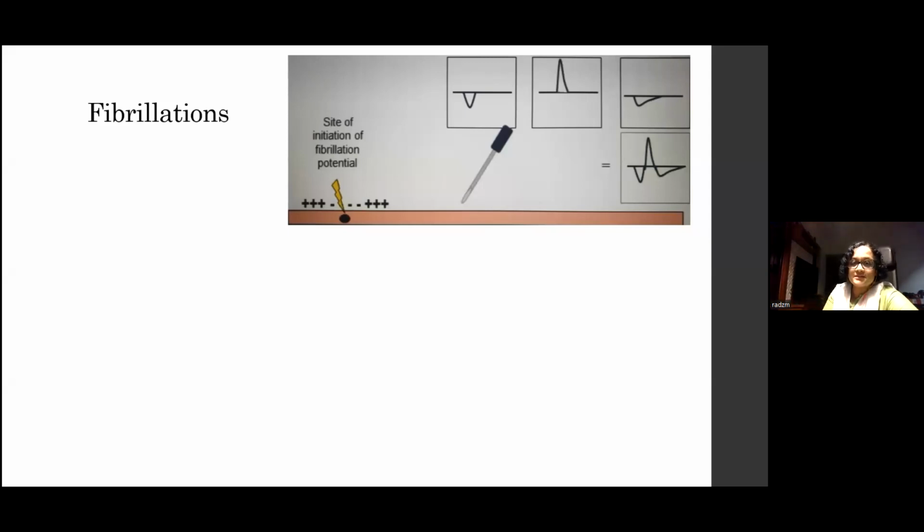So coming to fibrillations. Now, fibrillation is abnormal. It comes because there is damage either to the muscle fiber itself, as part of a myopathic process, because you can see fibrillations in myopathies as well as neurogenic disorders, or because the muscle fiber has lost its innervation because of a neurogenic problem, and it has become a so-called orphan muscle fiber, at which point it gives out fibrillations on its own. It has its own pacemaker, which gives out these potentials called fibrillations and positive sharp waves.